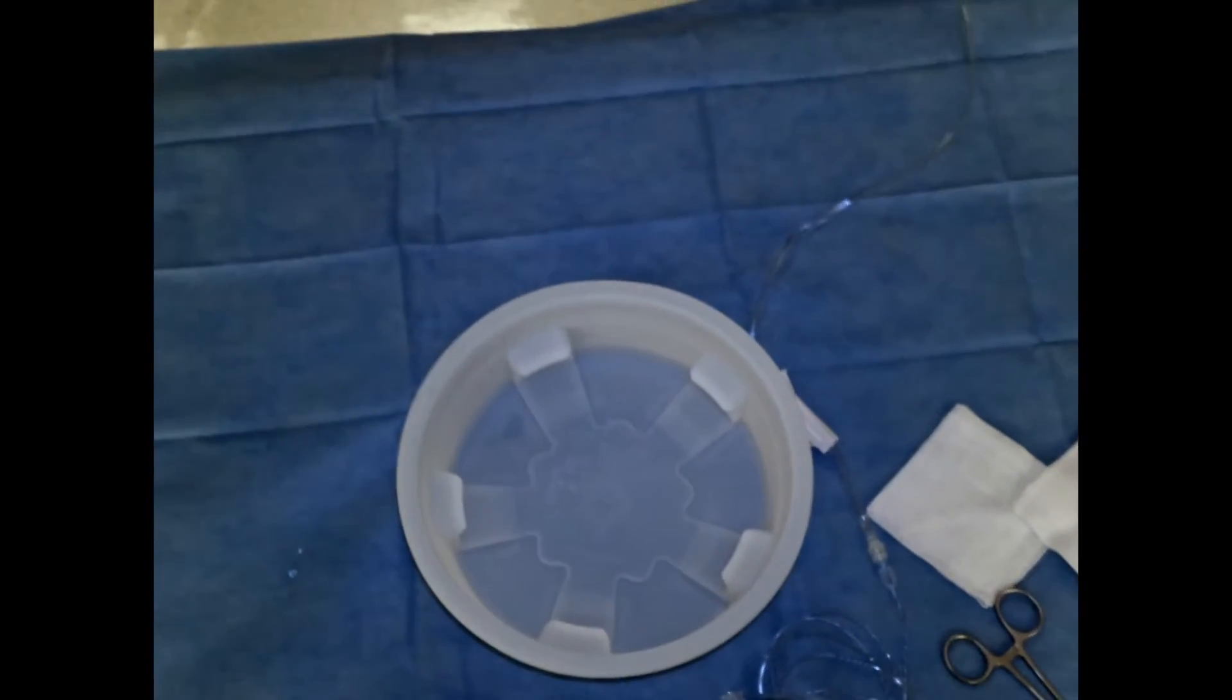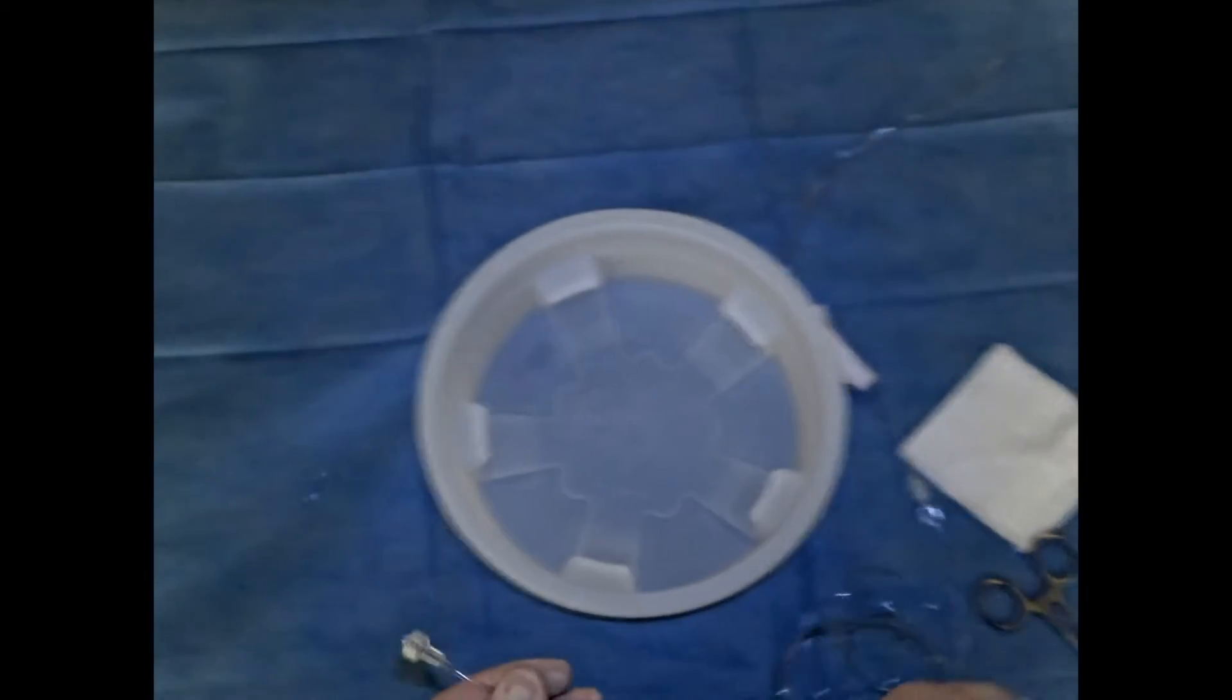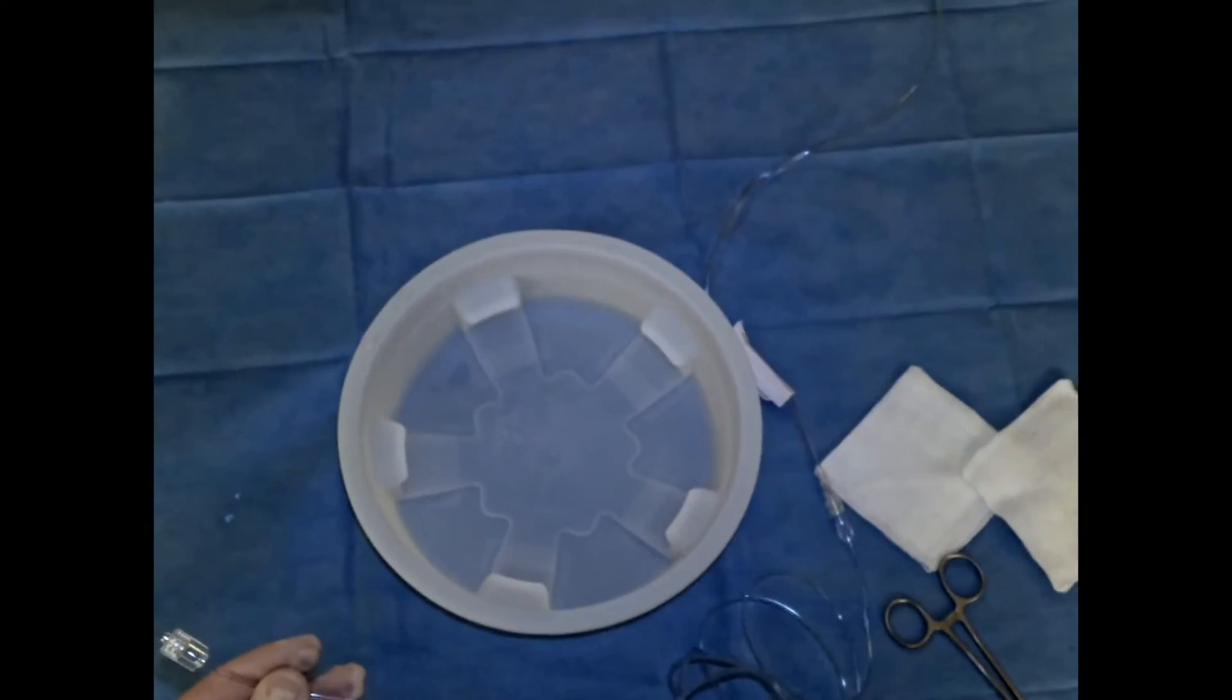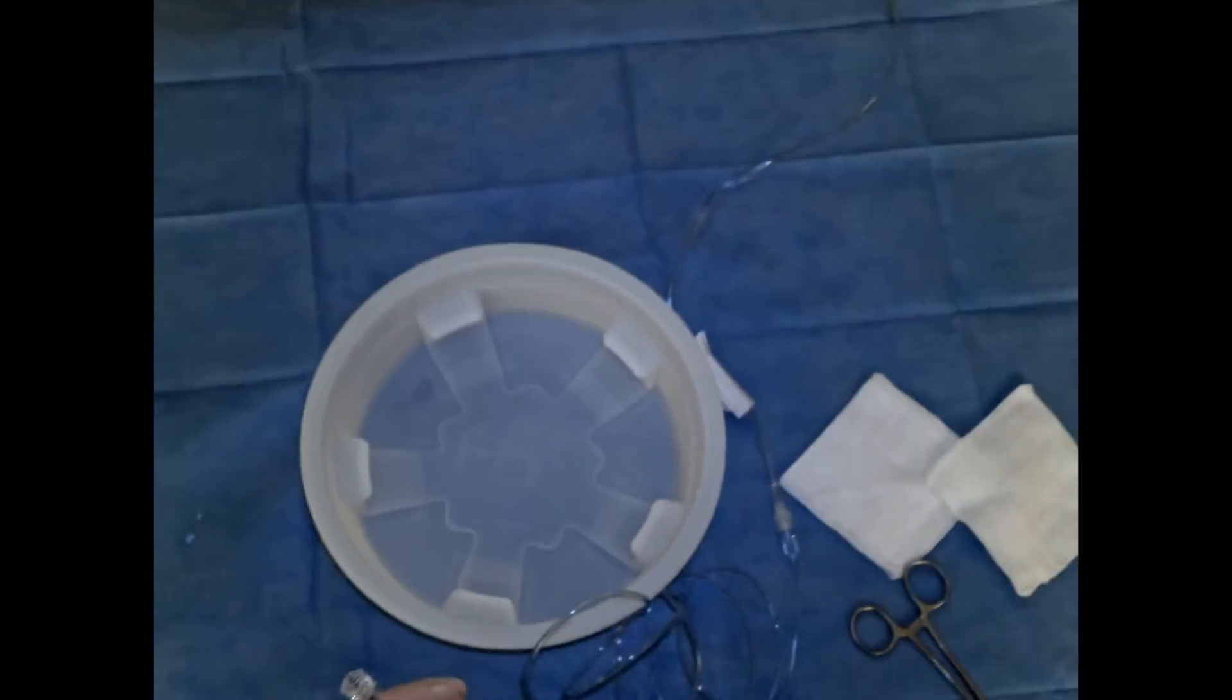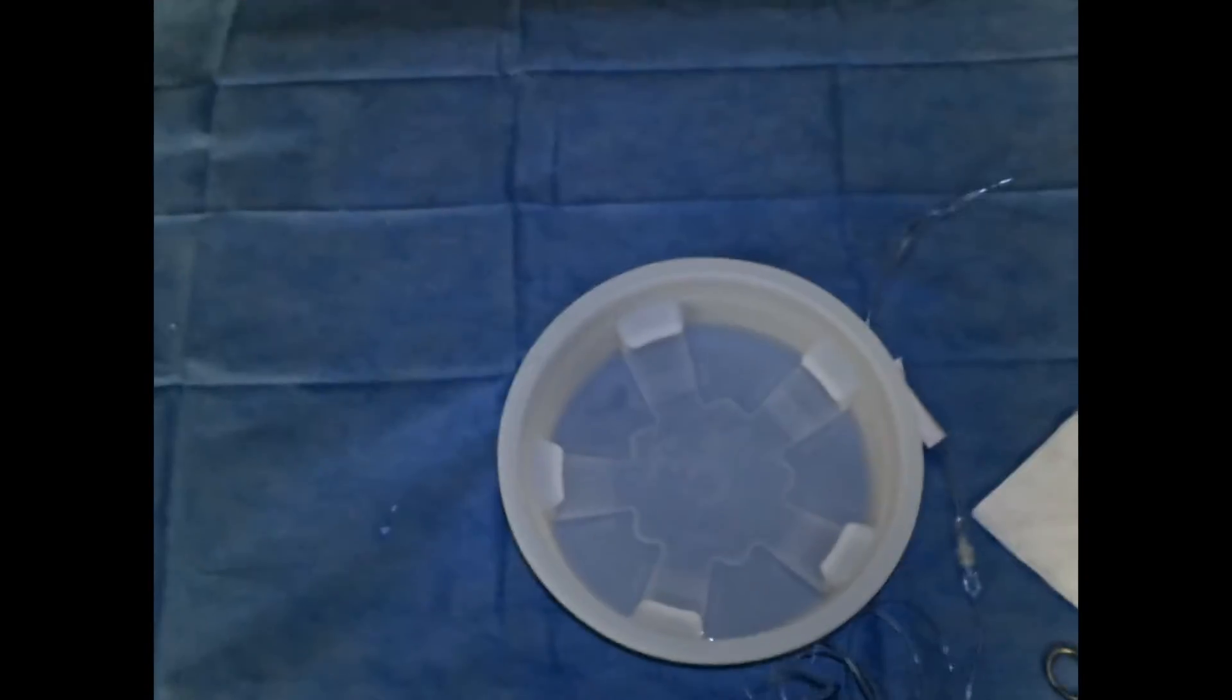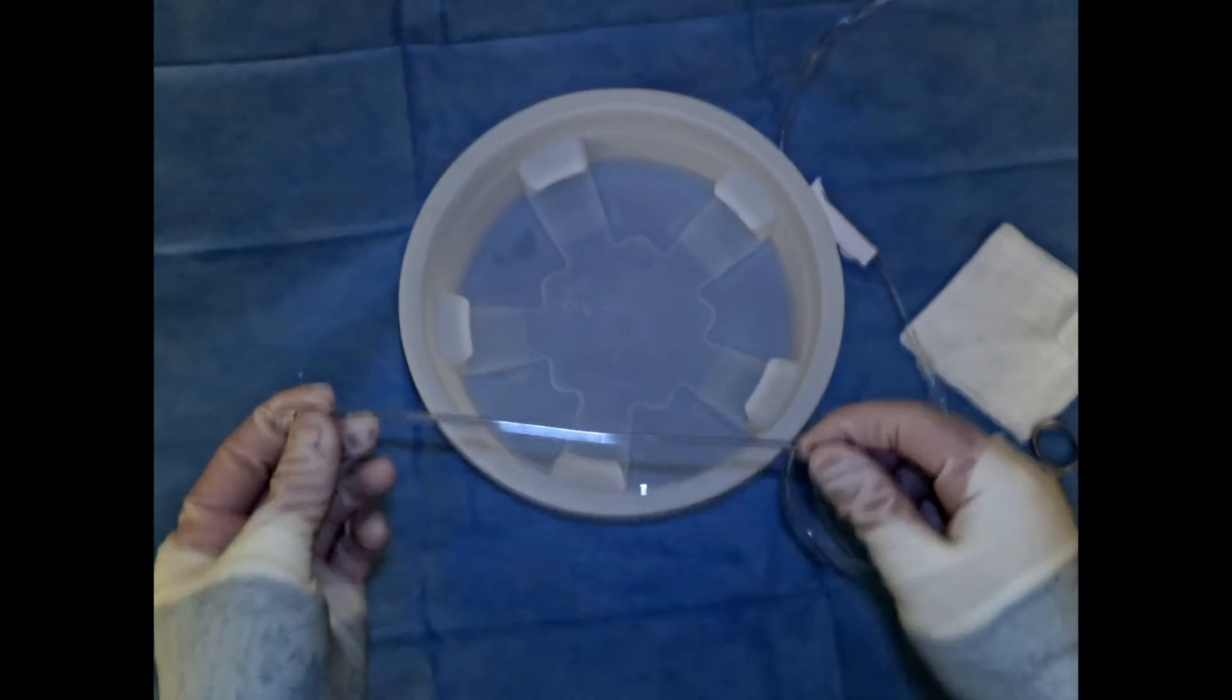In this video we're going to go over how to flush a drip line to prepare it for a neuro-IR procedure. The principle here is very simple: we're going to work very hard to take all air or air bubbles out of this system so that we don't introduce them during our case.